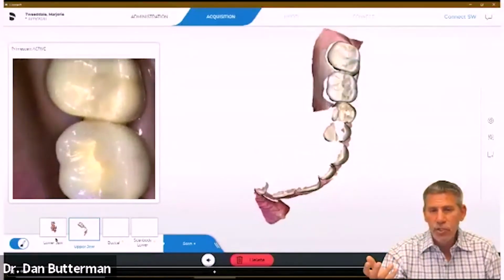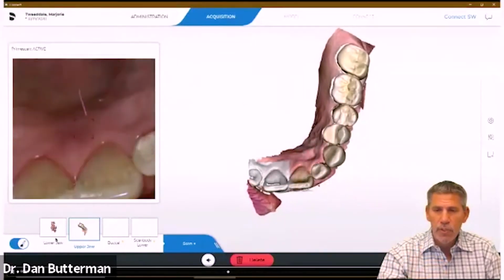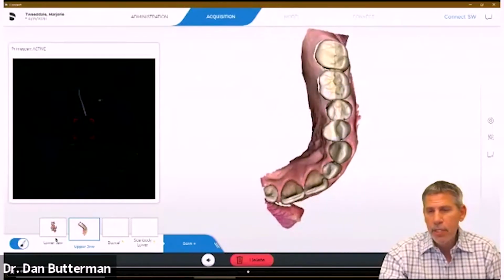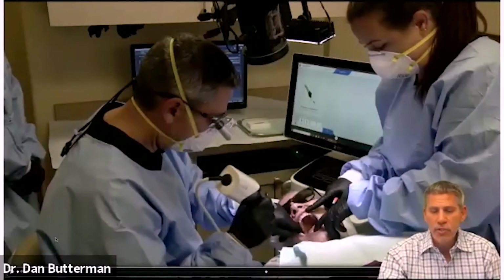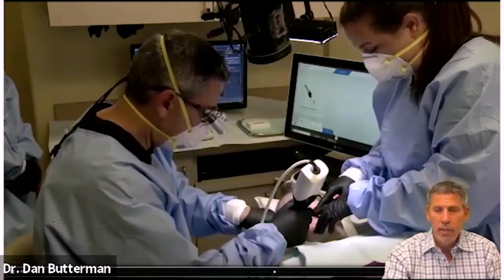Now, this was a guided surgery, so the surgery only took a few minutes. And so we're going to be doing all of our imaging. Now, I could have decided on this case to image just for the custom healing abutment. But on this case, I figured, well, why not just go to the final? Because again, we're not going to expect many tissue changes from the punch, and I'm not going to have an issue with tooth movement here.